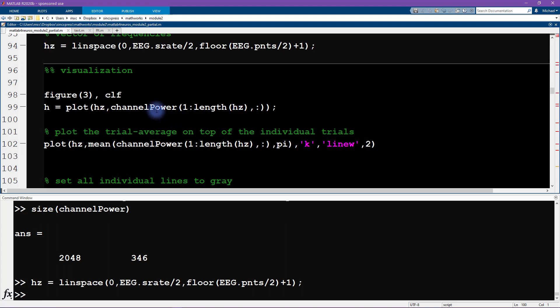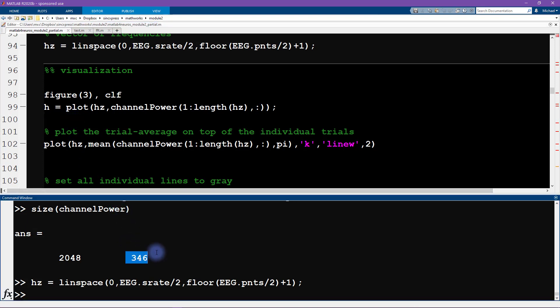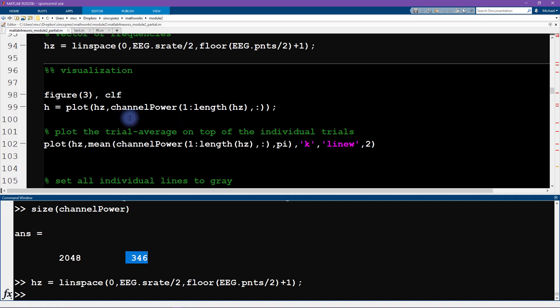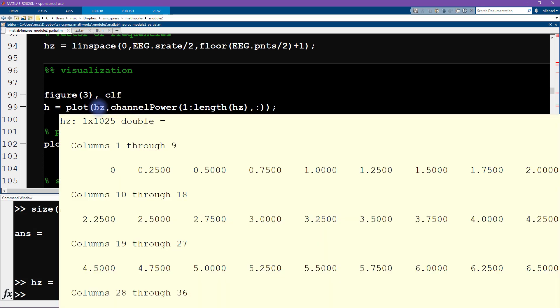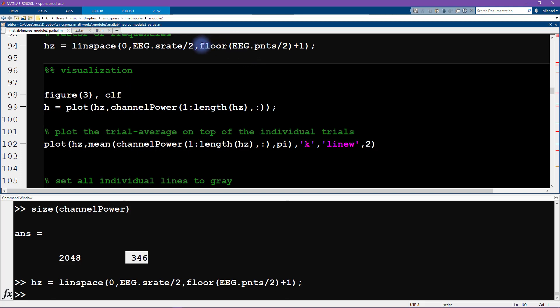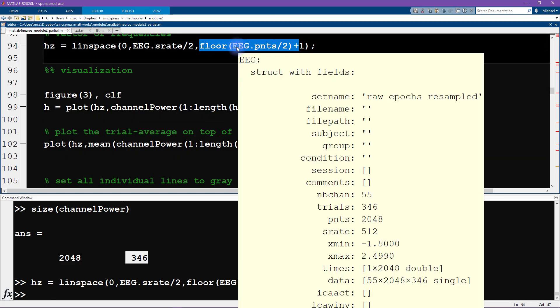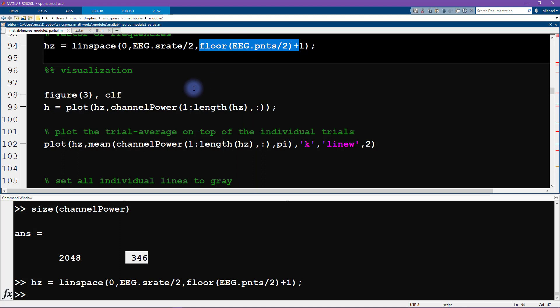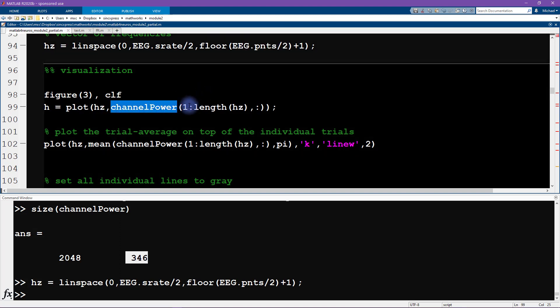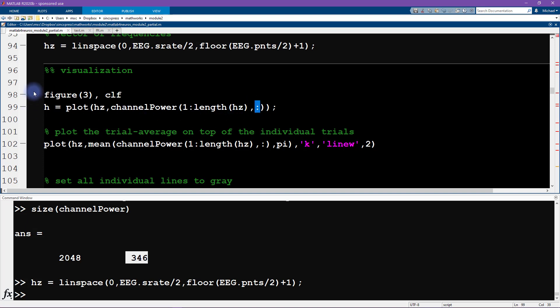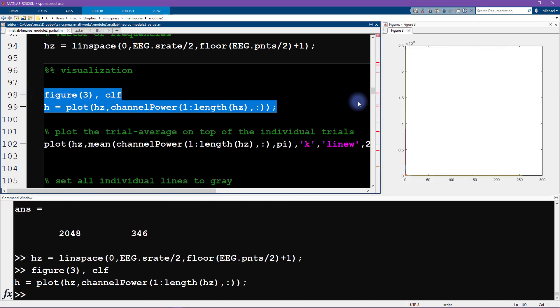Now let's go for the visualization. Remember, we want to plot two things: we want to plot all of the power spectra from each individual trial in gray lines, and then on top of that, we want a thick black line corresponding to the average over all of these trials. Let's start by plotting all the single channel data. The vector of frequencies hertz is only 1025 because we're only interested in half the spectrum corresponding to the positive frequencies. We're plotting only the first number of elements corresponding to the length of this frequencies vector, and we want all the trials.